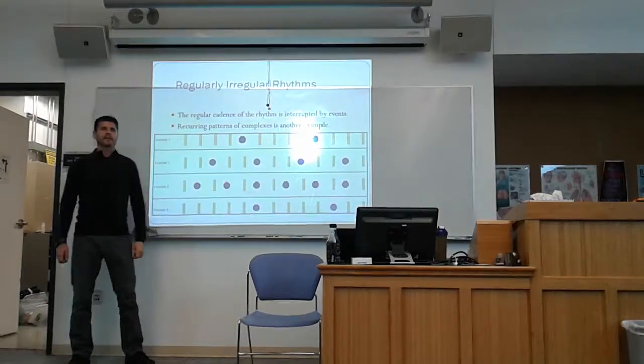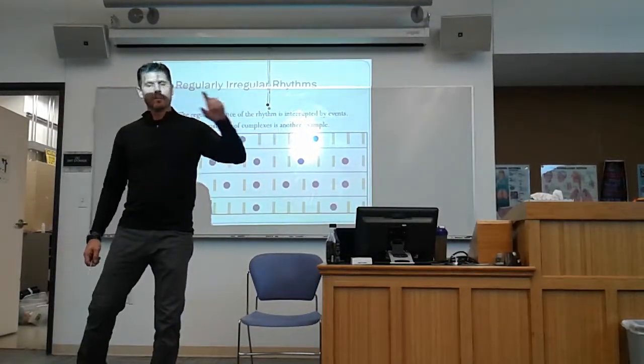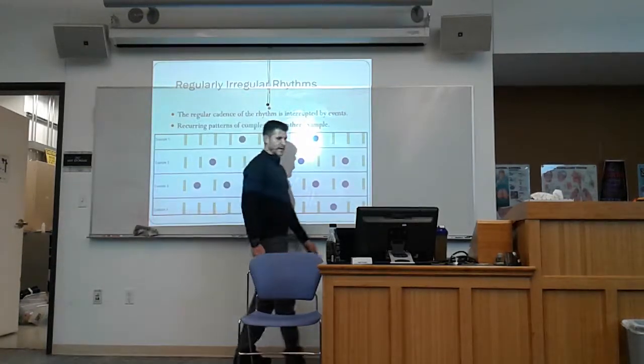Questions on that? You find a pattern in it, but it's not equal all the way through, but you identify the pattern in it, it's regularly irregular. Regularly irregular.